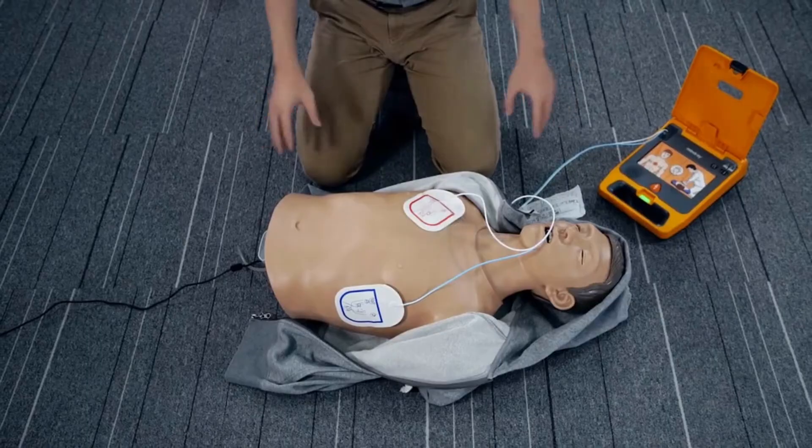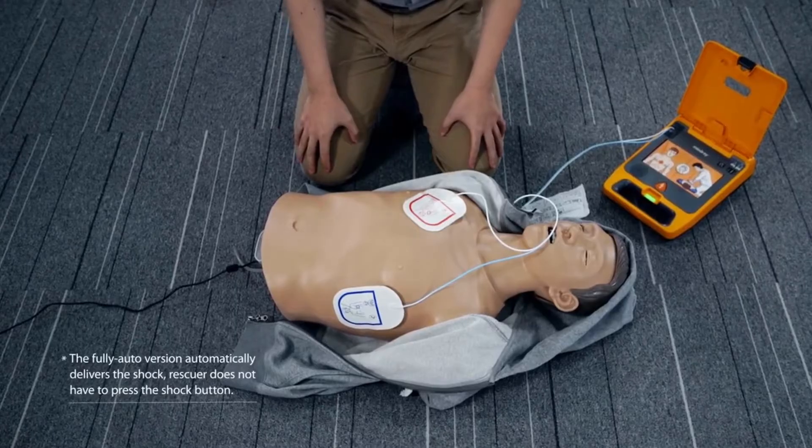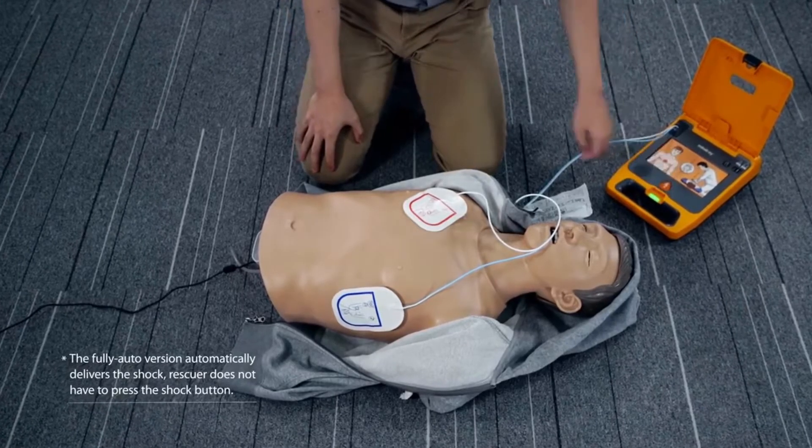Do not touch the patient. Analyzing heart rhythm. Shock advised. Shock delivered.